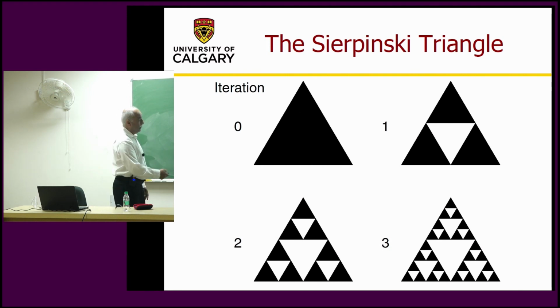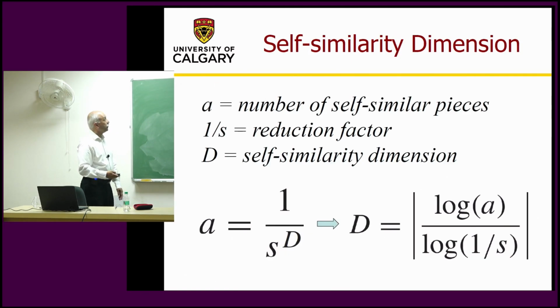So here you see the presence of it depends on whether black is object or white is object. One is the object, the other is the background, black or white. If black is the object, then white is a hole. So all these white parts are holes, lacunae.